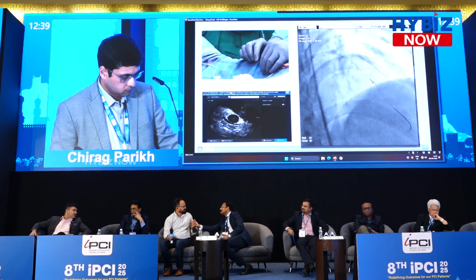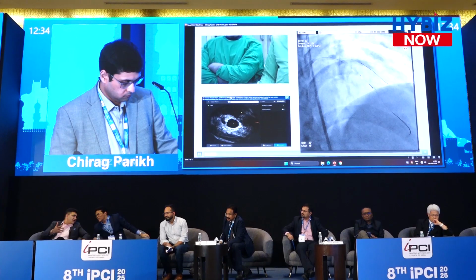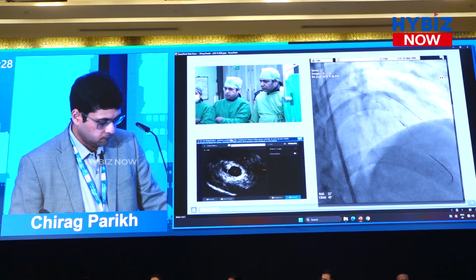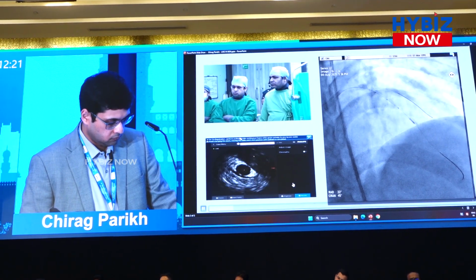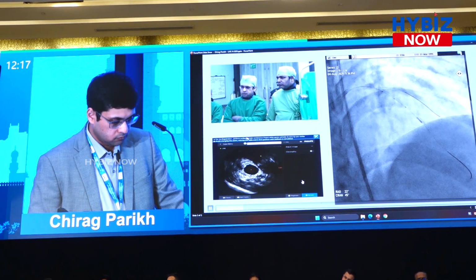It's important to find a suitable fluoroscopic angle where the entire length of the artery is visualized with a gradual pullback rate of about 1 to 2 millimeters per second. And as you can see on this catheter, there are 3 dots which can be used to measure the length in case you do not have the Syncvision system. And the distance between the 2 dots is 10 millimeters.